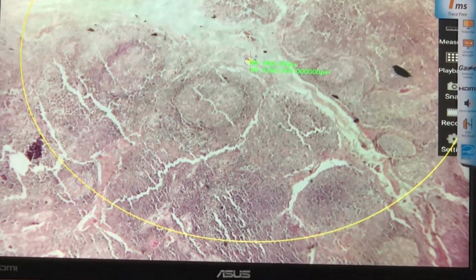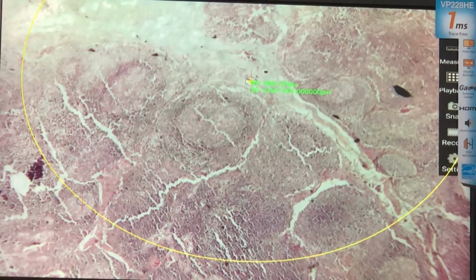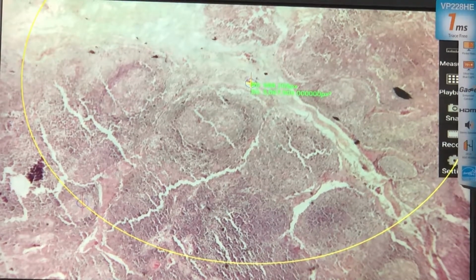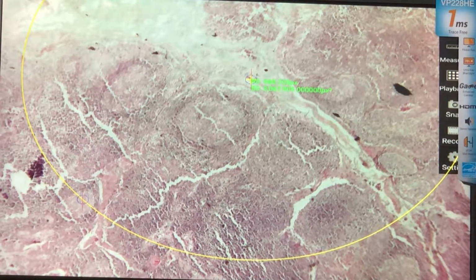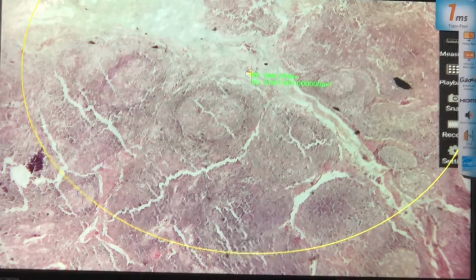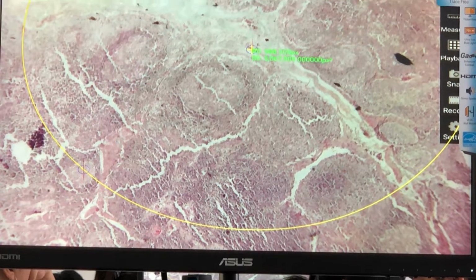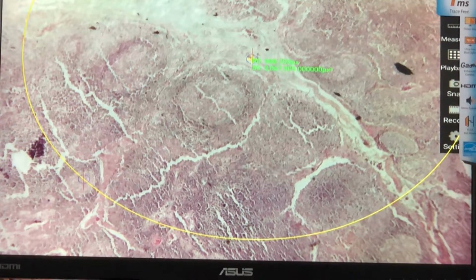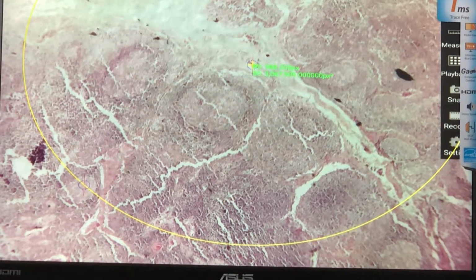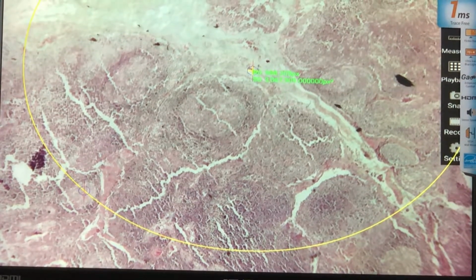So this is one slide which is very easy to identify in the practical exam, but easier said than done. If you didn't practice this, maybe you will identify this as an inflammation, especially when inflammation will be mixed with regressive changes, because I'm sure they will be mixed, because it will be no challenge if we only include this one, because there are few slides, so it will be easy to get perfect. We need more slides, so it will be a greater challenge for students. And basically these are related, so you should be able to differentiate.